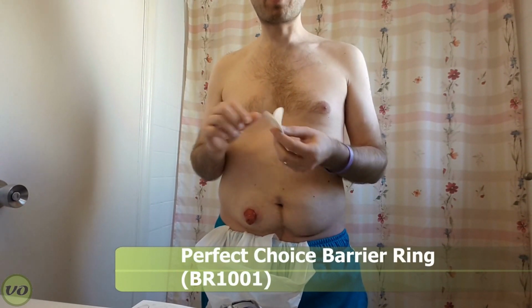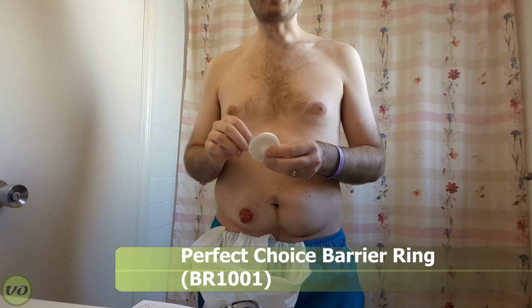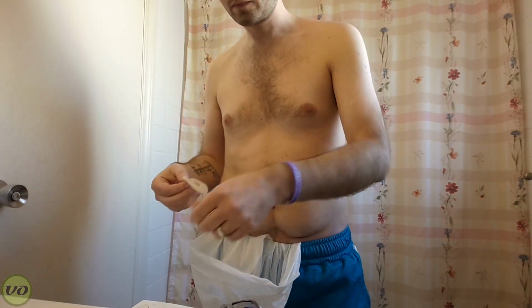For some people, they may find the thicker Eakin ring to be better than some of the slim Eakin rings. This particular product here is from Perfect Choice. It's the first time I've tried it, so I'll see how that goes, but you basically apply it the exact same way as any of the other barrier rings. So you basically want to take that ring and just open it up so that it gives enough of a hole so your stoma can fit through without there being any gaps around there.